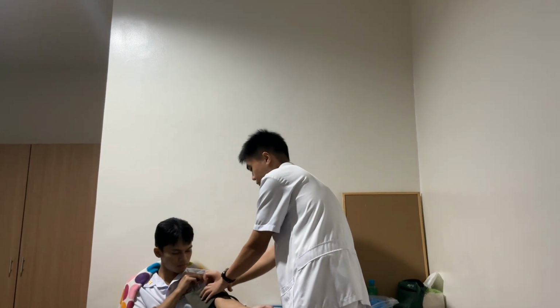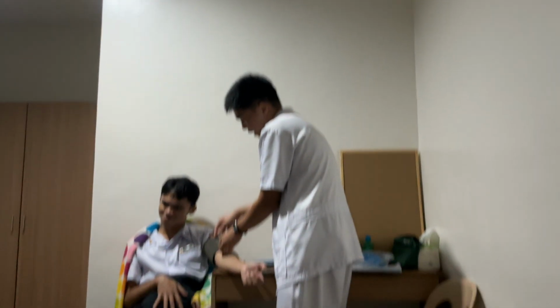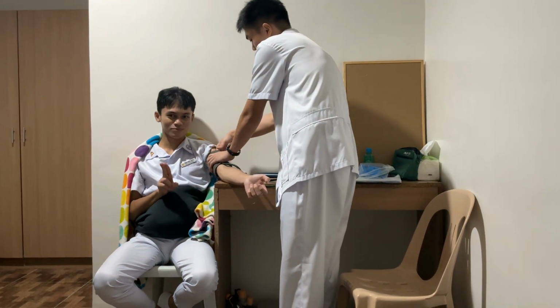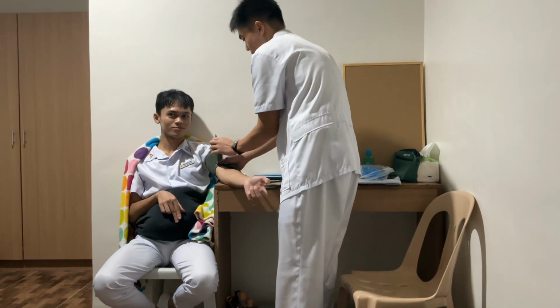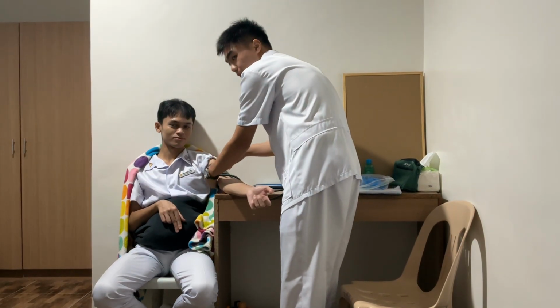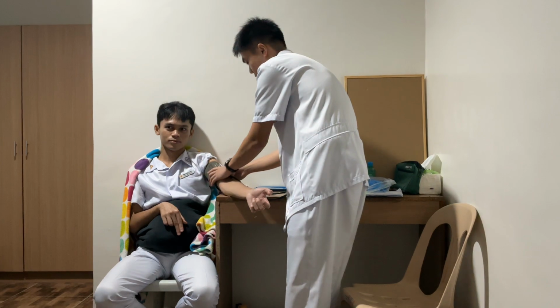How do we know that? First, we can ask the patient, ma'am, is it too tight for you? Okay. It's okay for the patient. Then we can check, put 2 fingers inside of the cuff. If it is too loose, then adjust. If it is too tight, you cannot put your 2 fingers inside of the cuff to adjust. So mine is too loose, so I'm going to adjust. Upon doing so, it's enough.